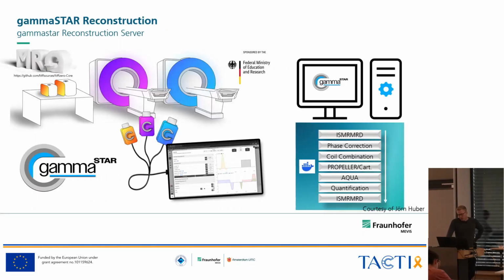So basically all of that is then collected inside a so-called Docker server, which is basically a way to provide programs to different locations or systems. And inside that, we have our reconstruction toolbox and this processing toolbox, and this simply runs at all of your systems which are in front of you.